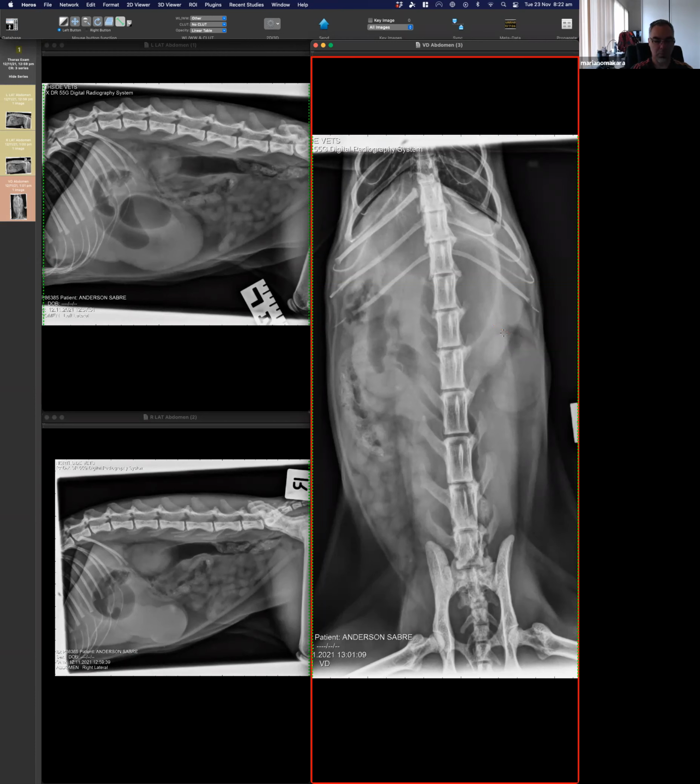okay, anything else? Keep on moving on. Are we ready to make a call? I've got a couple of questions more than statements, I guess. This cat doesn't look particularly fat, and yet if you look at its kidney, particularly on the left-hand side, it's really well demarcated. And as Bronwyn said earlier on, the whole abdomen is really well defined. So I don't think this is necessarily a pathologic thing, but I'm just curious, do you think that's just fat that's making it so well defined? Or is it just that you've got a great X-ray and a great X-ray machine? I don't know. Yeah, good point.